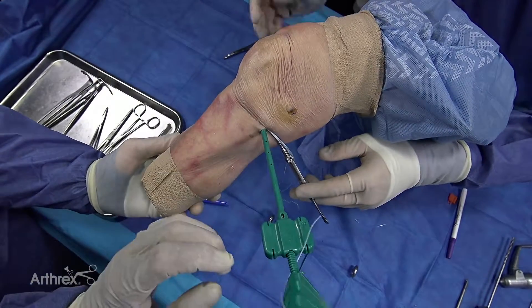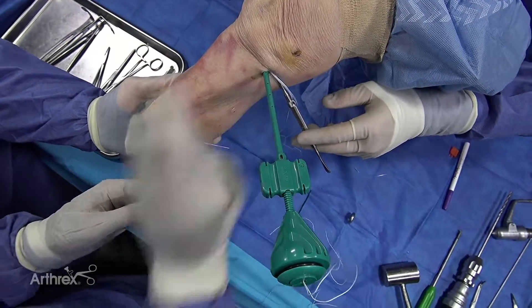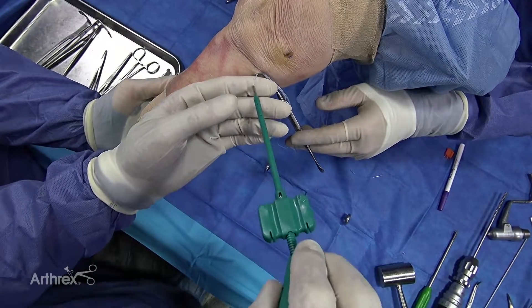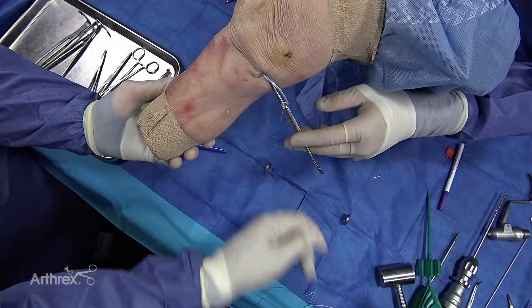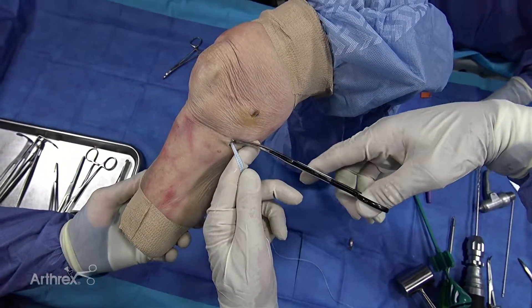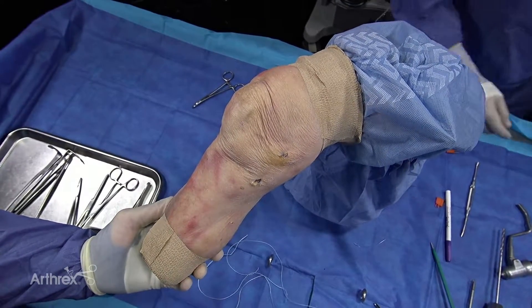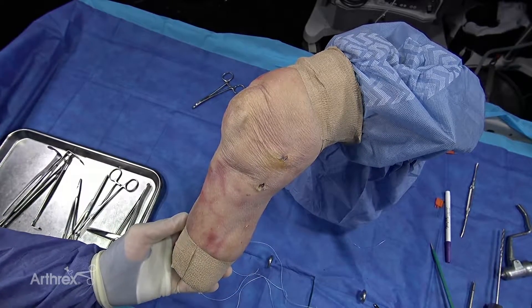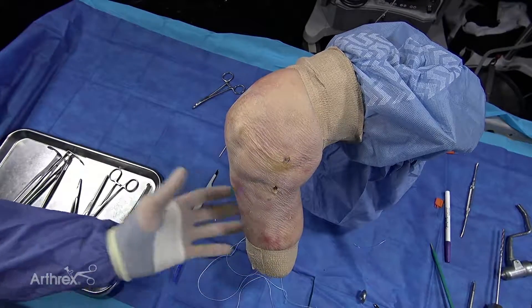You insert this fully, you undo the wires. Now, remember, if this was torn off distally, I may make a little bigger incision and use these to incorporate into the distal medial collateral ligament. For this case demonstration, we don't have to do that. So we simply pull these off, take out the freer, and simply cut that off. And that is how you do it. Thank you very much. I found this technique to be very reproducible. It's very quick and easy, especially if you use this cannula so you don't get lost in the side of the knee, especially with some of the bigger players that we do.